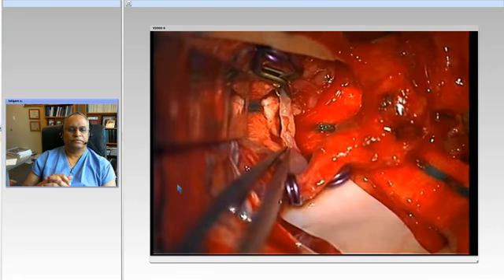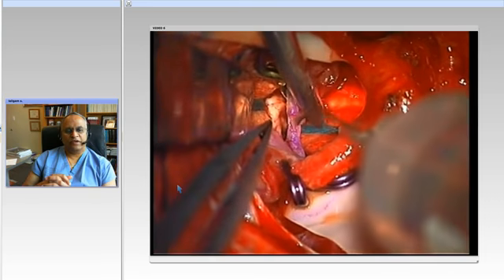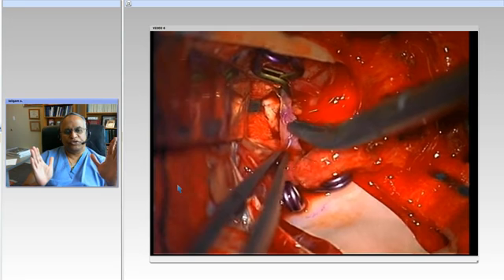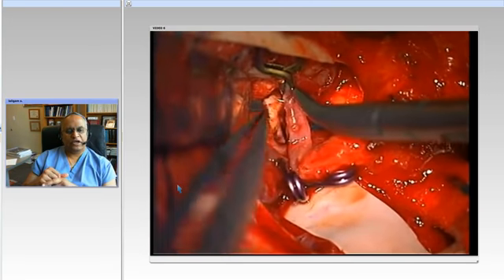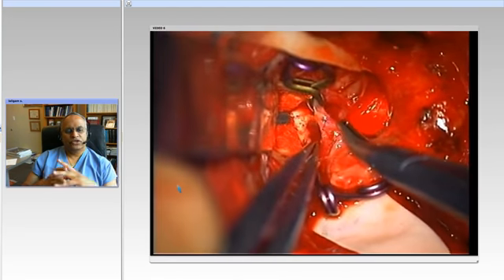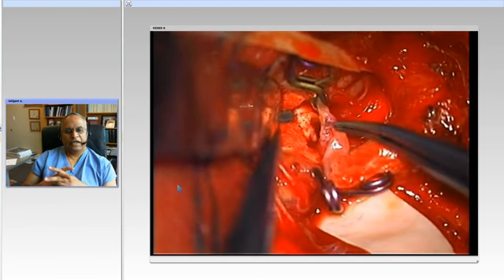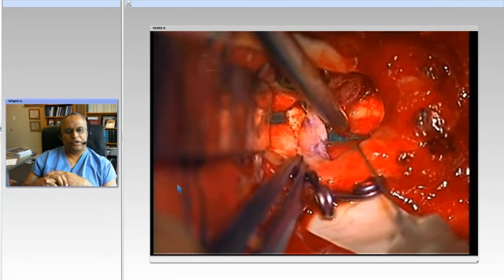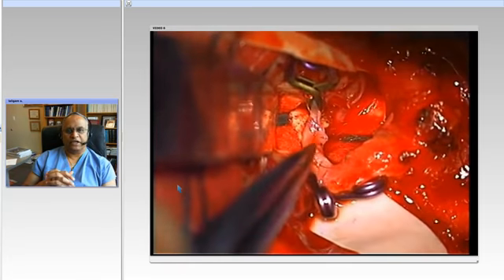Opening the vessel. And then marking it with a marking pen, and then we'll flush through with heparinized saline. The marking just shows you nicely the wall, so you don't stitch the other wall. So here now we are suturing with 10-0 nylon. So we suture the 2 ends of the graft, and then we'll suture one side and then the other side, either using continuous or interrupted. I probably use, in this case, continuous on one side and interrupted on the other side.